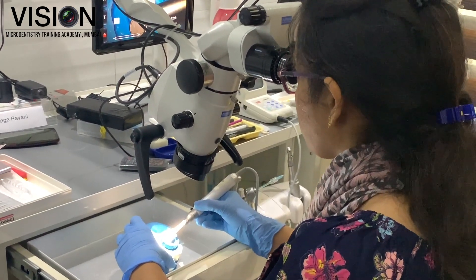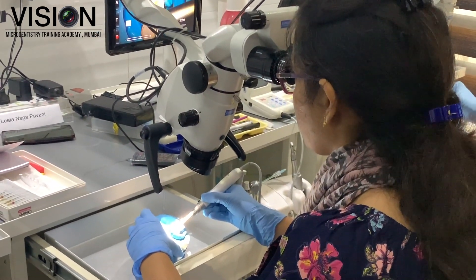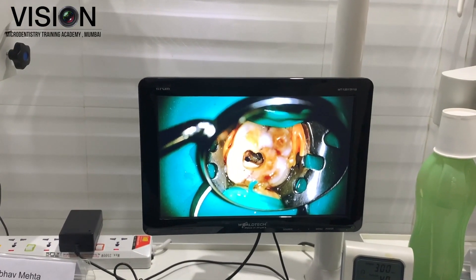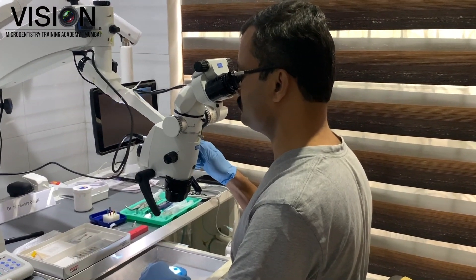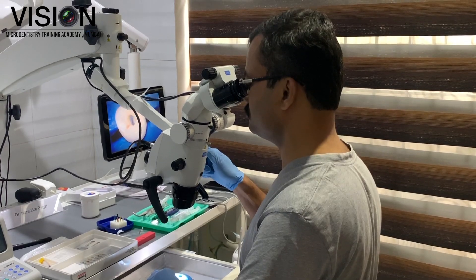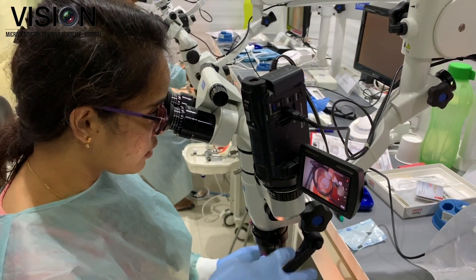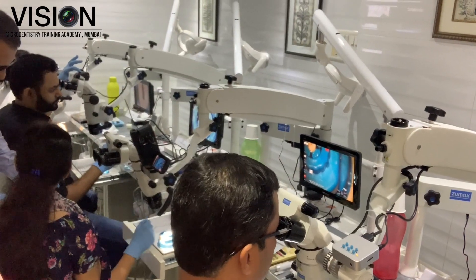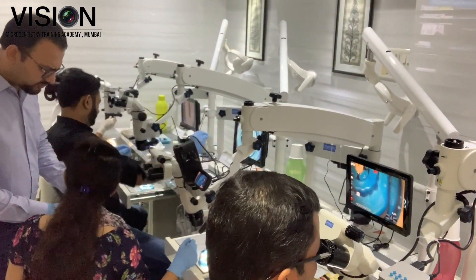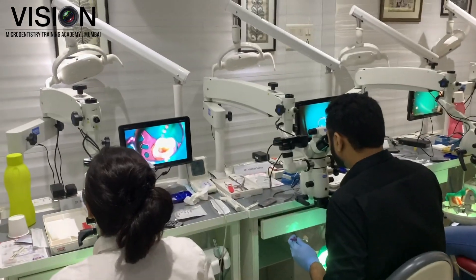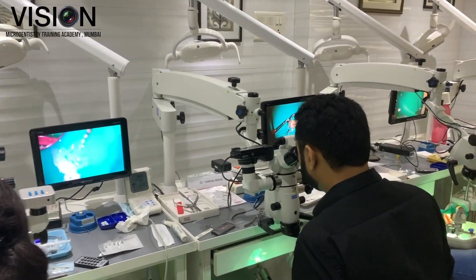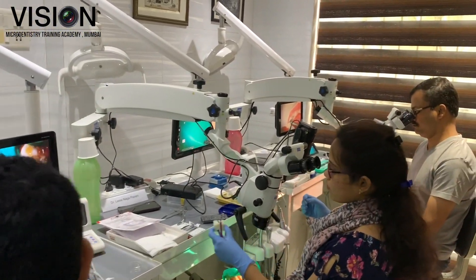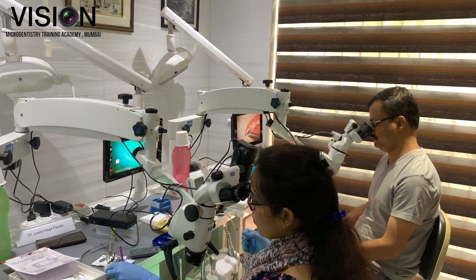Besides learning how to use the microscope and learning concepts such as IPD, parfocaling, and the dominant eye, participants also get to learn various ways they can do documentation under the dental operating microscope. In addition, participants get to take home a recording of the various hands-on exercises they have performed and can view and revise them at a later date.